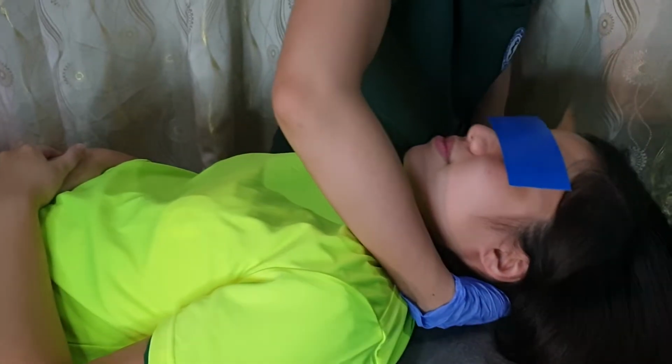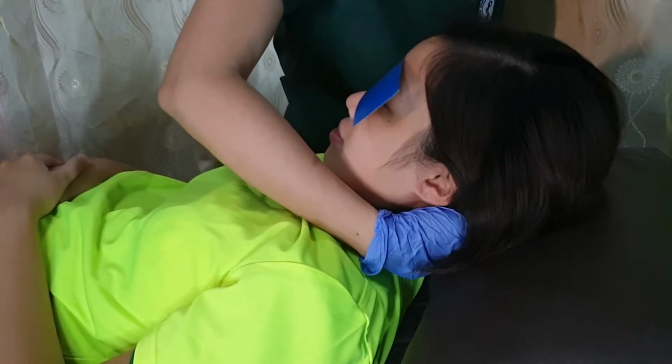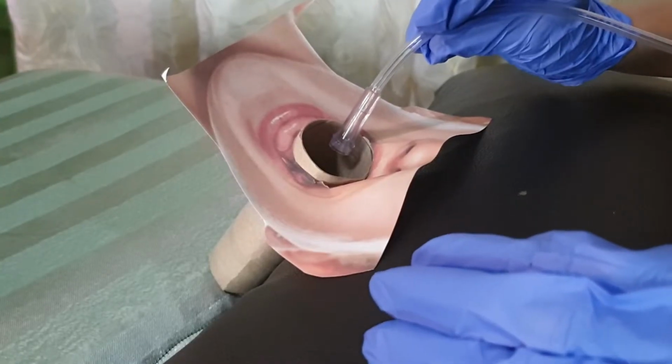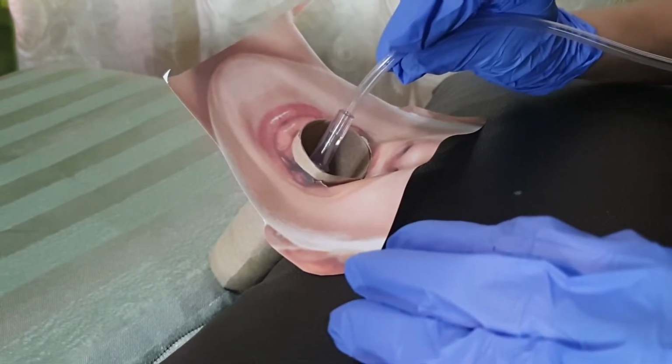While the materials are already prepared, place the patient in a sniffing position by putting a pillow under her head. This would provide a cervical flexion of about 30 to 35 degrees. Then use a suction catheter to clear the patient's airway of any foreign materials or secretions.